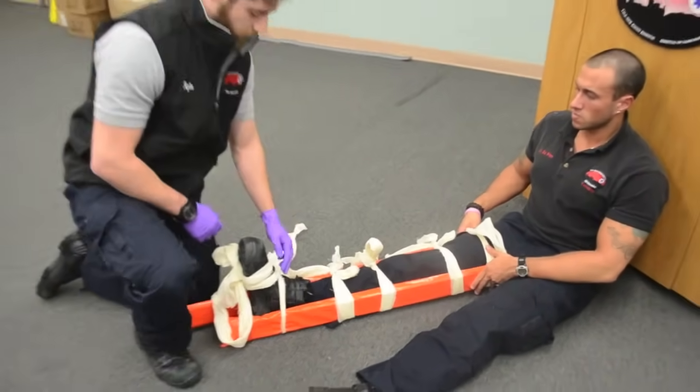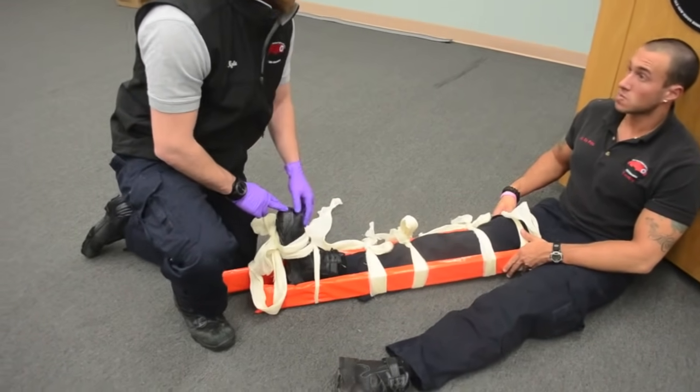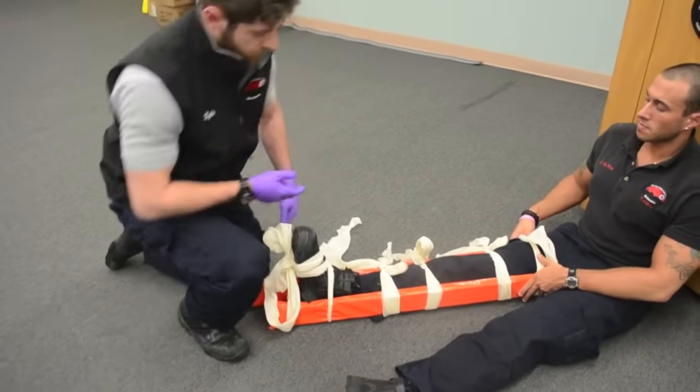Now that the leg is secured, I am going to double check to make sure that I have PMS. Pulse is present. Sir, can you feel this? I can. Can you push up on my hand? Push down on my hand. PMS is intact.